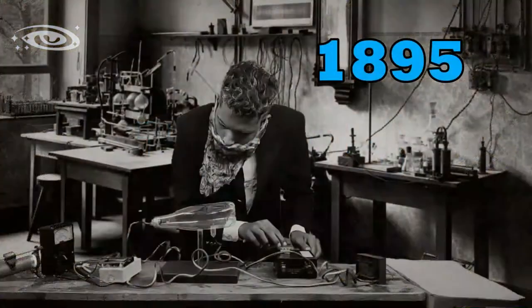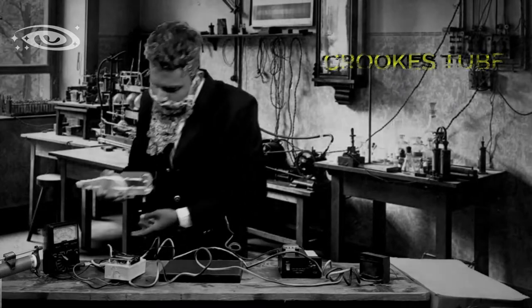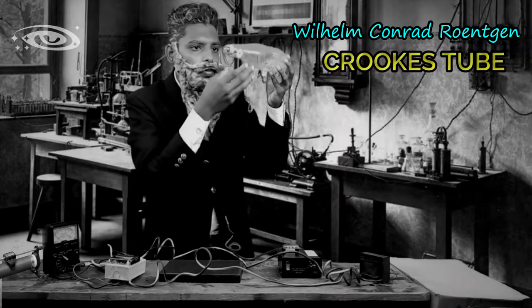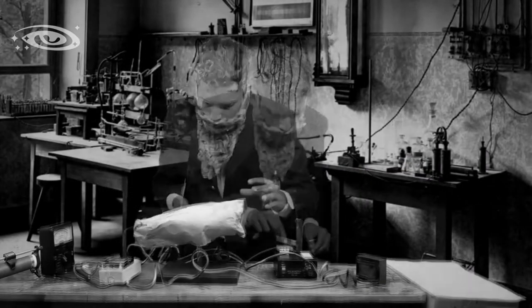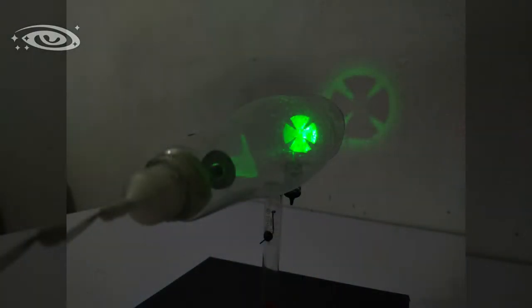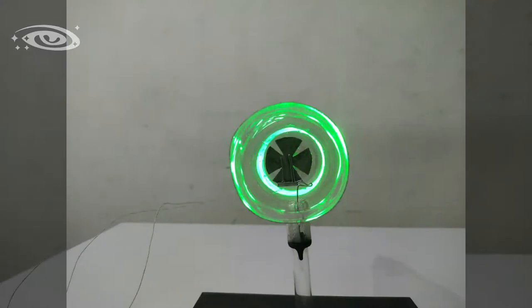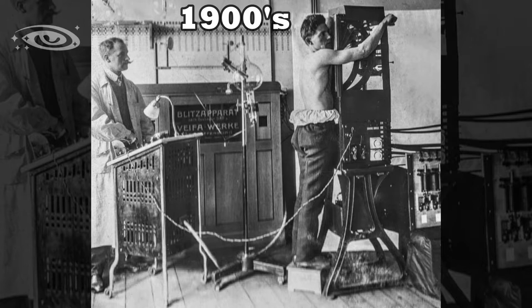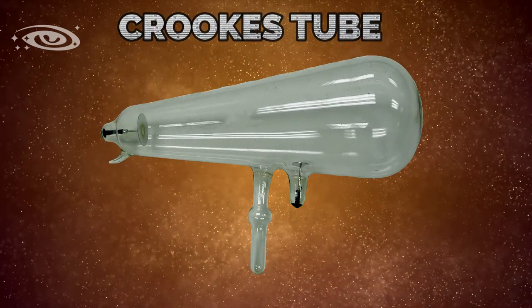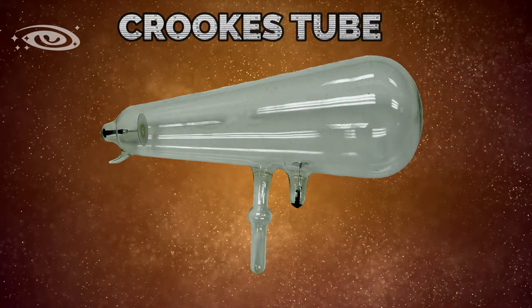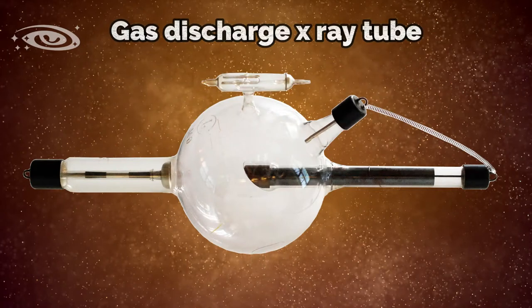In 1895 X-rays were accidentally discovered in the Crookes tube by Sir Wilhelm Roentgen. From here first generation of X-ray tube was started. After many years of studying about these X-rays, finally they were used in 1900s for diagnostic purpose in the medical field. By using this Crookes tube, the X-ray intensity is very less. So they modified this Crookes tube and that tube is called gas discharge X-ray tube. Even though after modifying this Crookes tube, X-ray intensity is also not that much.